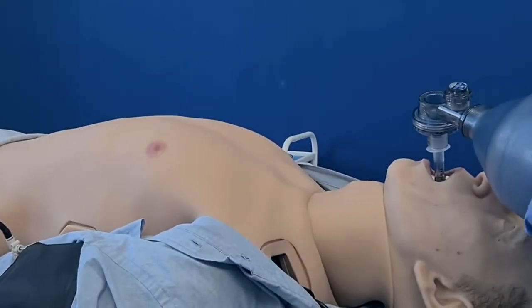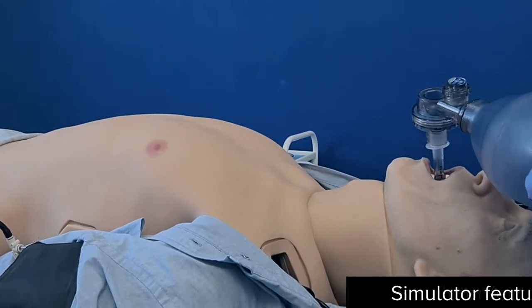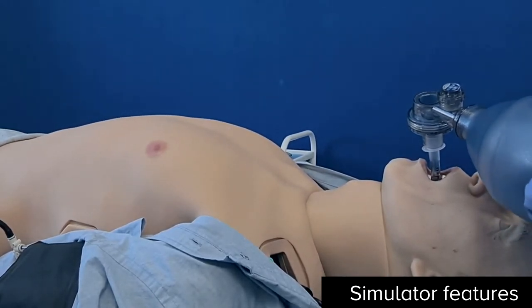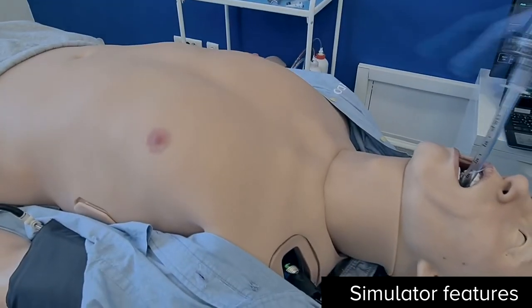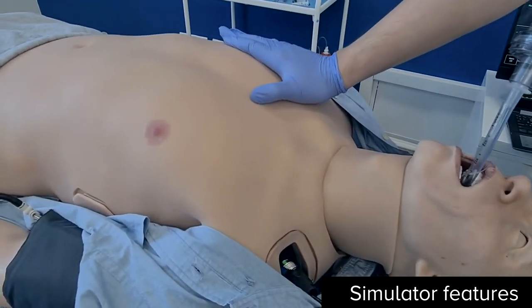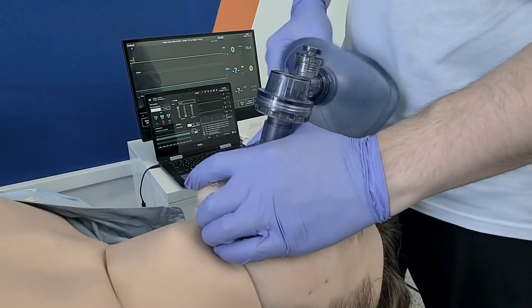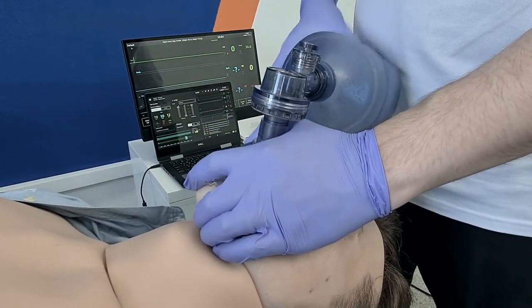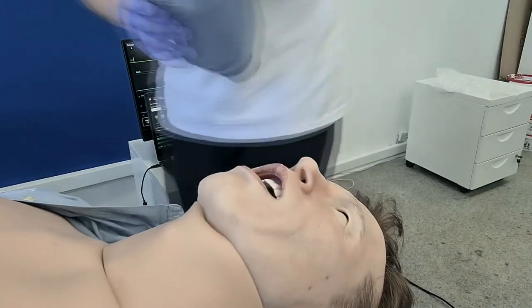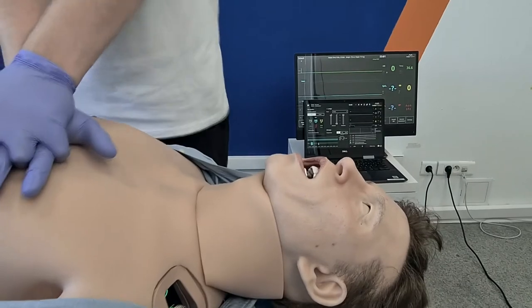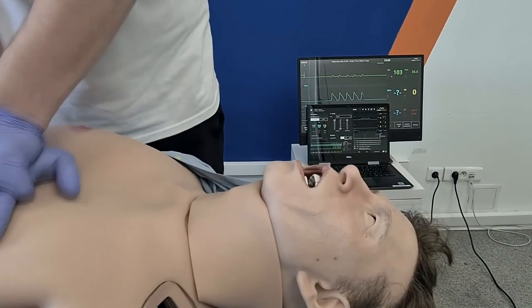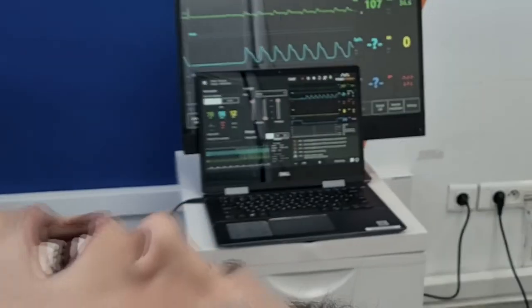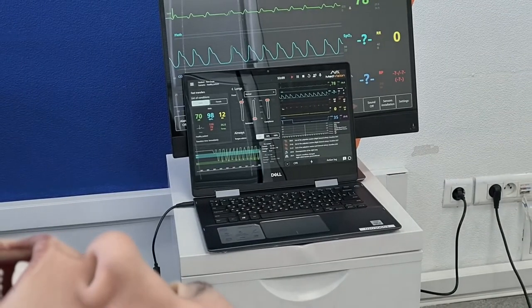Leo can be ventilated with a mechanical ventilator or a BVM. The chest rise and fall looks very realistic — biological rather than mechanical. When ventilating Leo, the introduced oxygen is registered in the software in the bottom left corner. Chest compressions feel natural rather than mechanical, with uniform motion. Chest compressions also produce ECG artifacts and realistic waveforms.